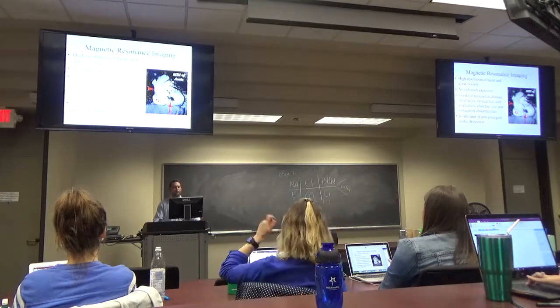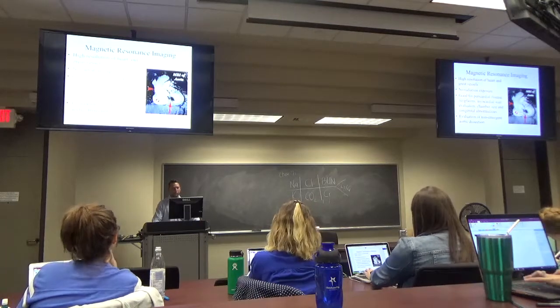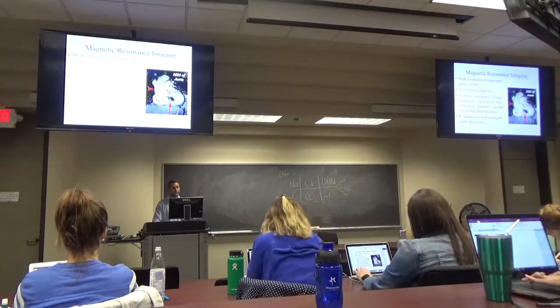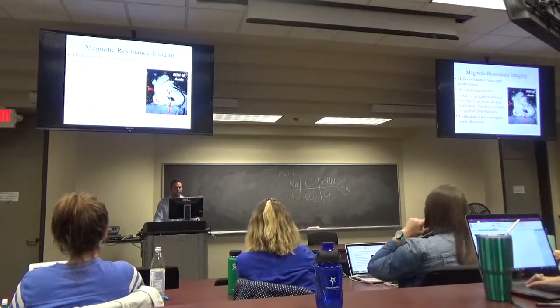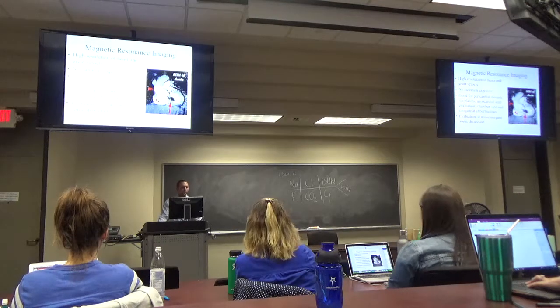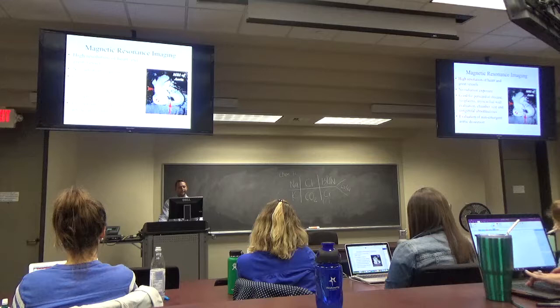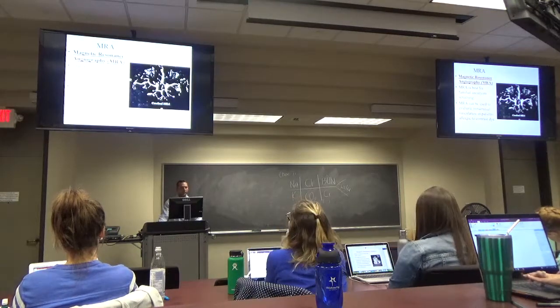A lot of times these have to be non-emergent things because if someone's having a huge MI, you don't want to send them into an MRI that's going to take 30, 40 minutes when they could have already been revascularized. But there are some things that MRI is good for, especially neoplasms, wall evaluation, chamber size, just to look for enhancement in the walls. But we won't go too much into it, just know that it's there.